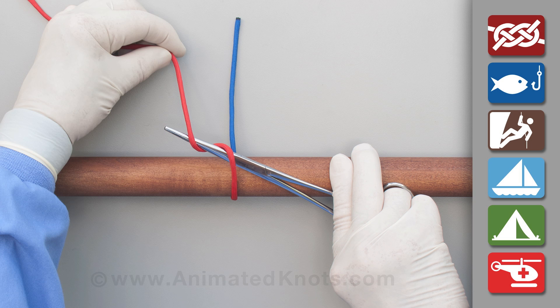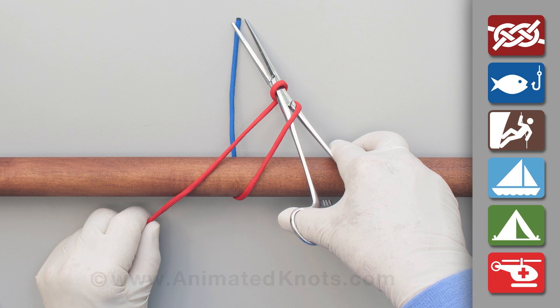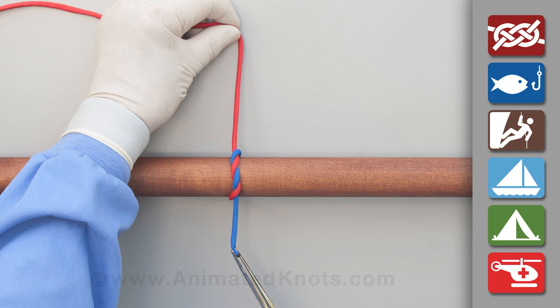under, over, and then under the forceps. Use the forceps to reach for the short end, pick it up, and pull it tight to make the double throw knot.